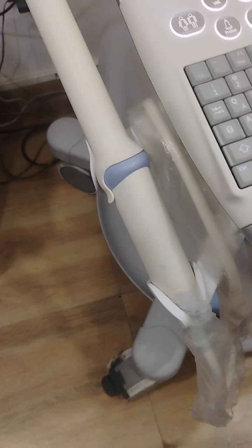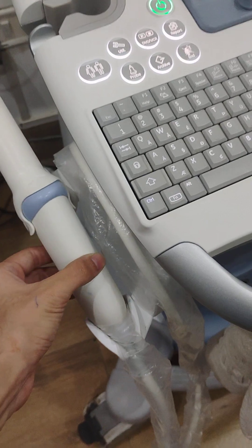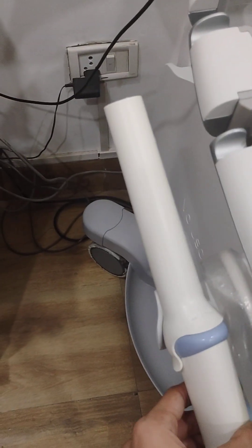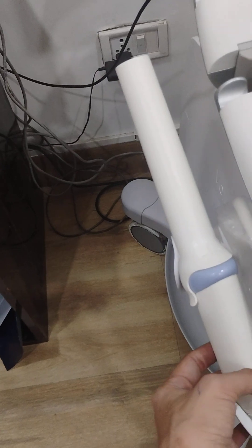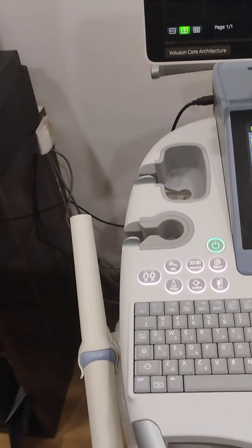This is the probe which is used to perform transvaginal sonography. And there is another test which is called TRUS — TRUS is for male patients. I am not going to tell you all about TRUS and transvaginal sonography here; you can search yourself if you want to know about these two tests.